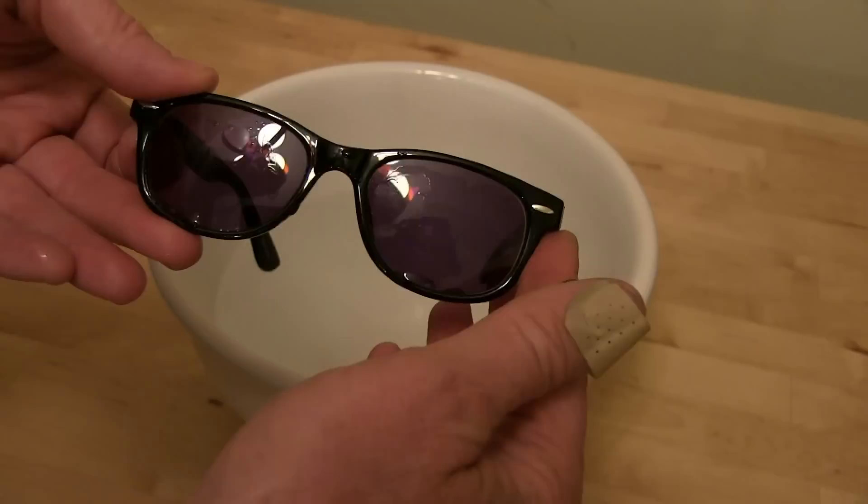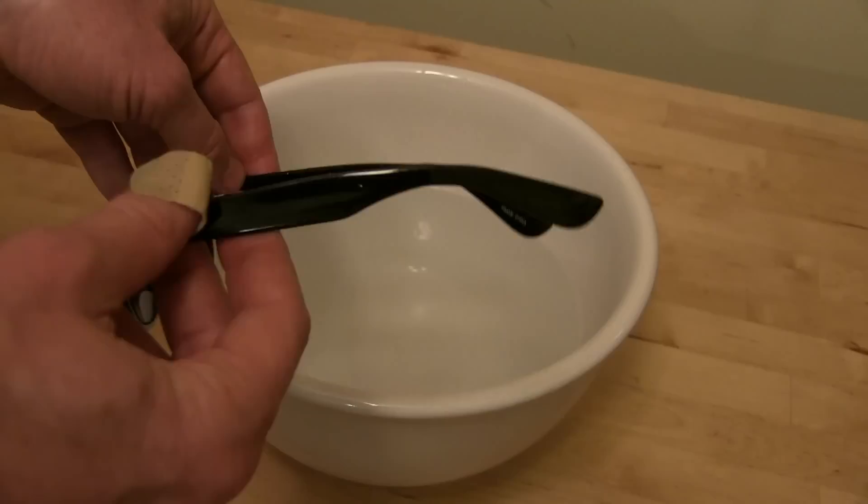That's all there is to it — just a little bit of hot water, not boiling, but hot bath water, and just gentle bending. No yanking.